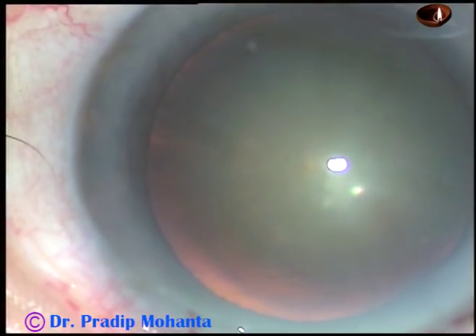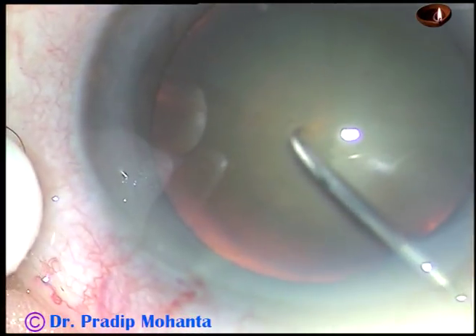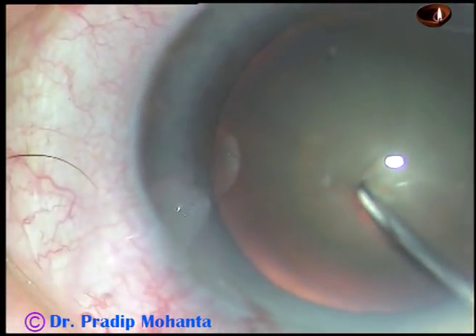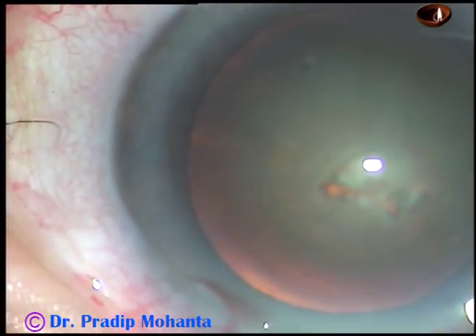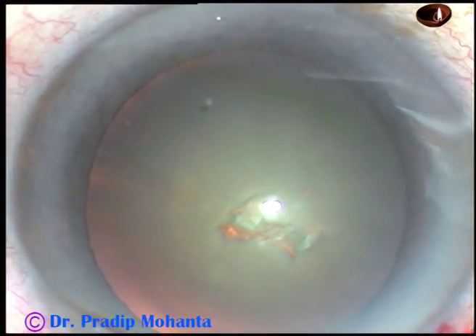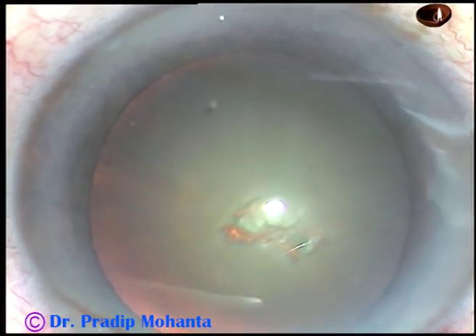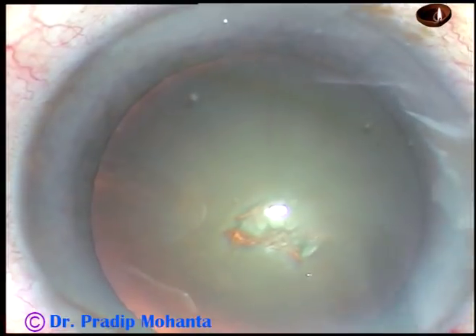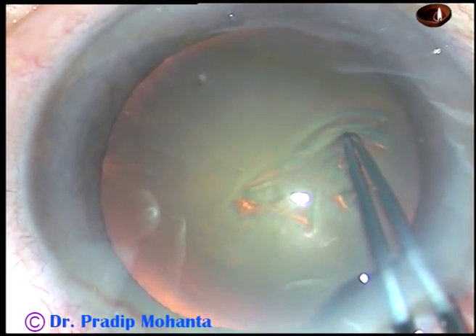And now, capsulorhexis. I incise the capsule with a 26-gauge bent needle and I find that the anterior chamber is very shallow. The IOL power selected for this eye is 34 diopters. However, I inject viscoelastic substance and continue capsulorhexis with utrata forceps.